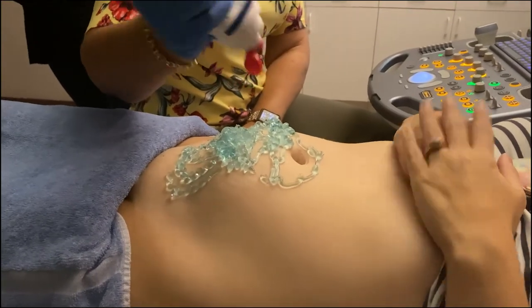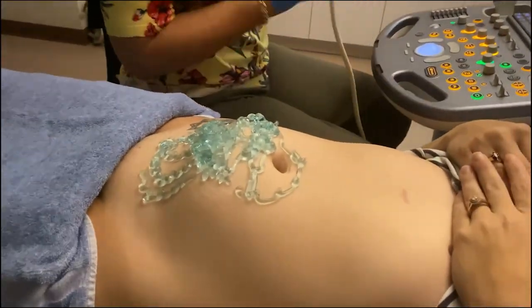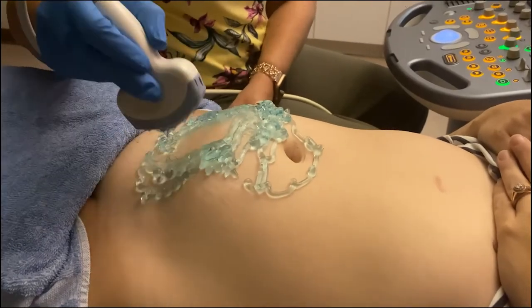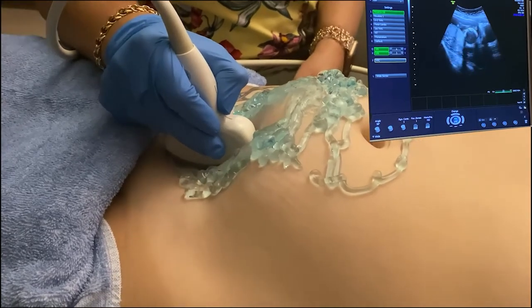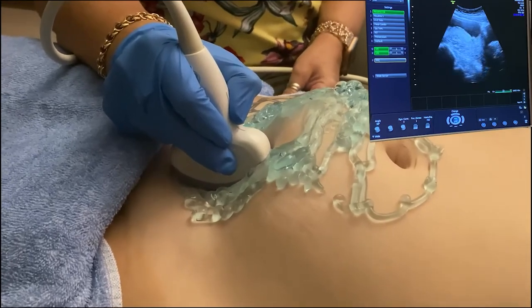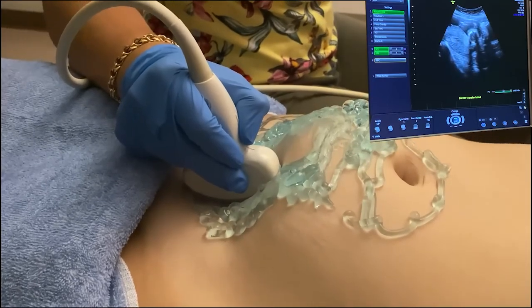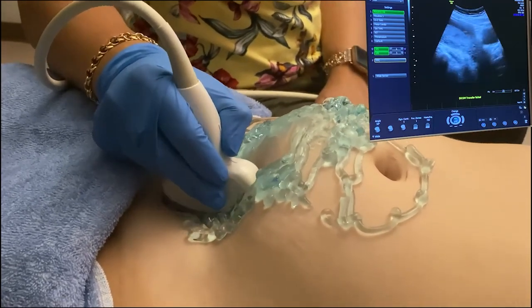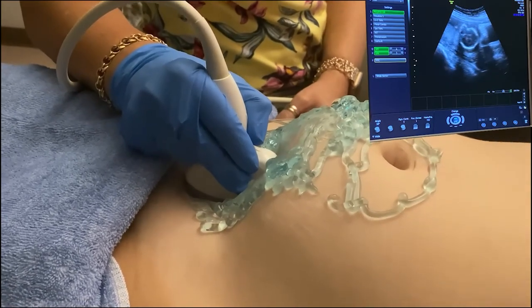The top of her uterus at this point in pregnancy, she should be 18 weeks and 3 days, is at around the umbilicus. Sorry. I'm going to start again at the 0 position and interrogate this patient and get fetal situs. Our only known is mom, and so we know that baby can be in any position that they want to be in. So we're going to take a picture of the lower uterine segment and show the presenting part of the fetus if we can.